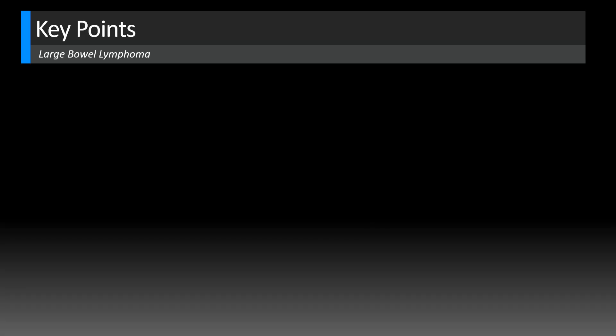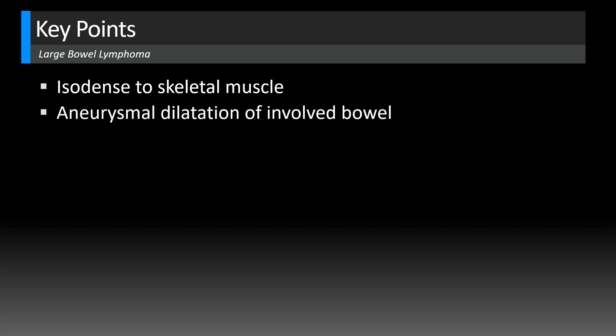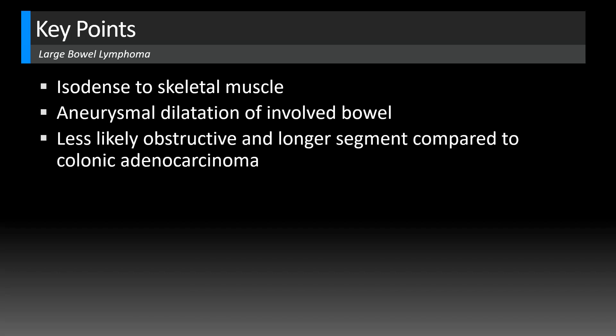Let's look at a few key points for large bowel lymphoma. It tends to be isodense to skeletal muscle — that's a good rule for abdominal pelvic lymphoma in general, whether it's involving the kidneys, liver, or bowel. There are times where it's heterogeneous, but that's less common. The growth pattern of aneurysmal dilatation of bowel, whether small or large bowel, is fairly characteristic of lymphoma.